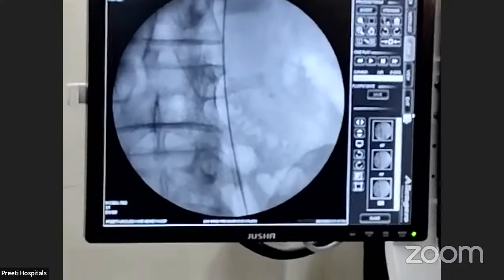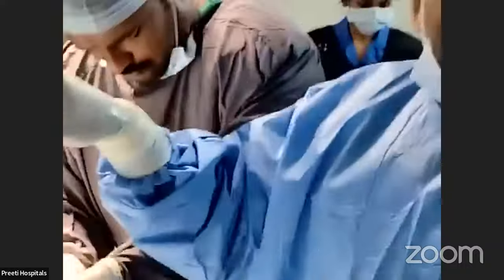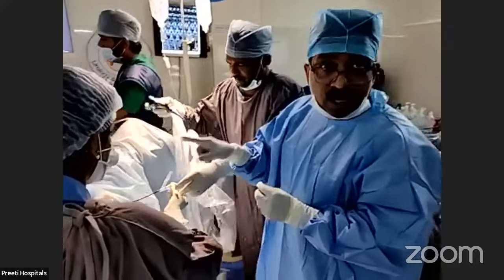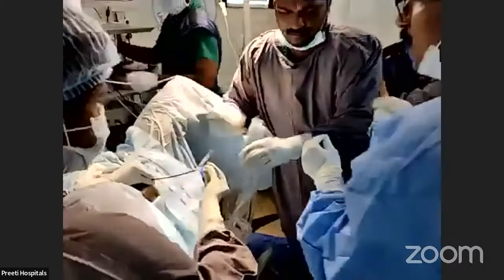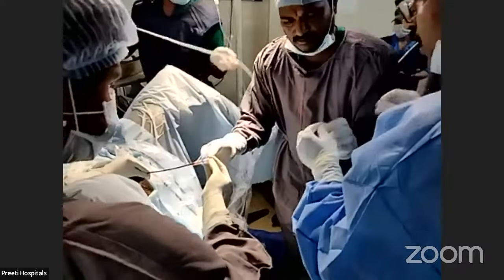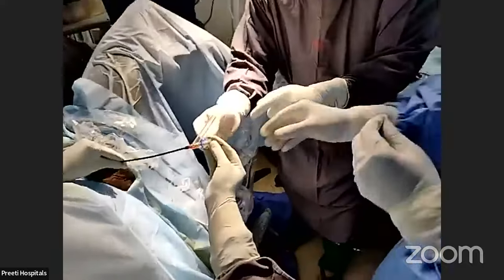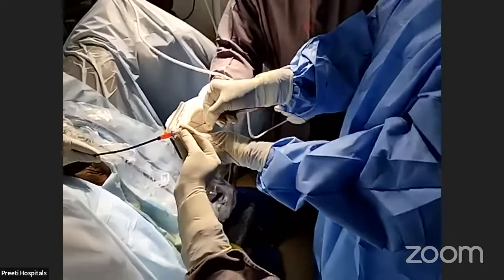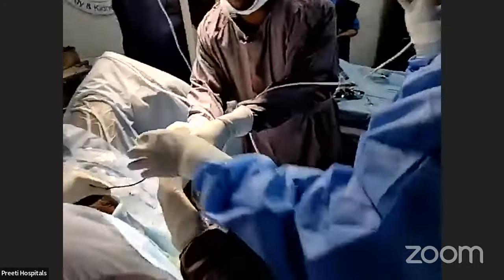Even post-stented, so ultimately the disadvantage of this procedure is if it doesn't go into the pelvis, you cannot do the surgery, but you can do RIRS. The only thing is we can, under vision, you have to take it out. You can put inside this. See, he is intelligent. He is telling.